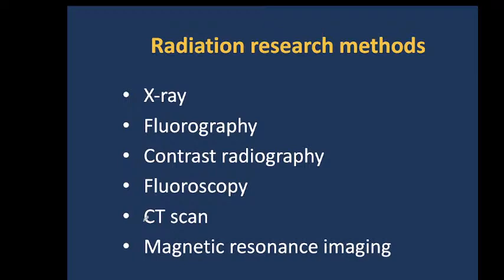Modern medicine offers an impressive list of X-ray diagnostic methods that allow not only to identify a wide range of diseases but also to promote their more effective treatment. Surely you have already met various methods of X-ray diagnosis.